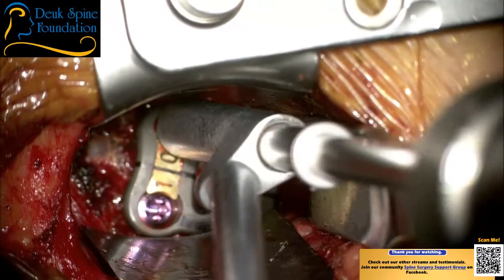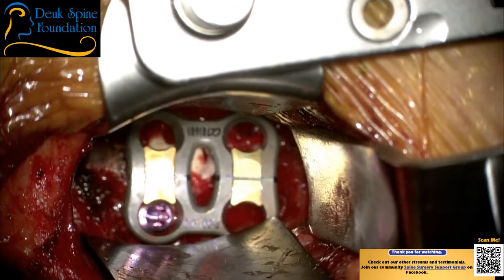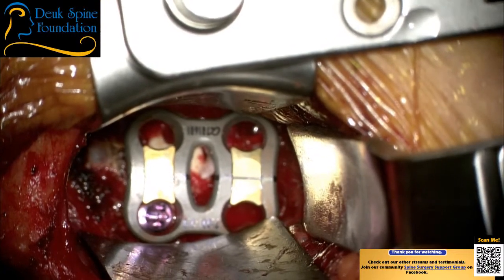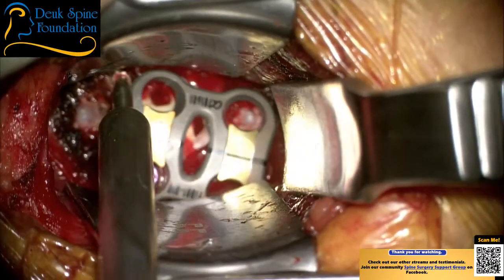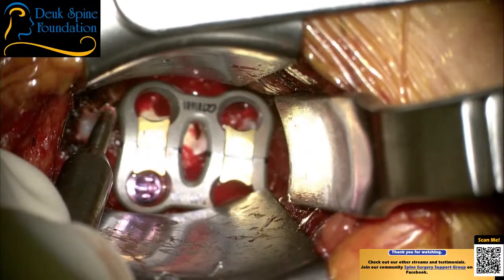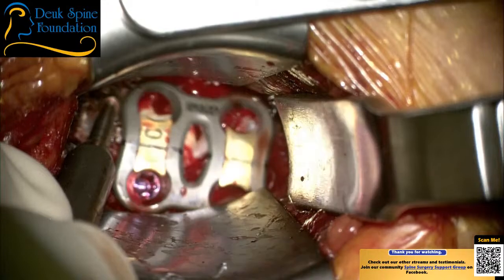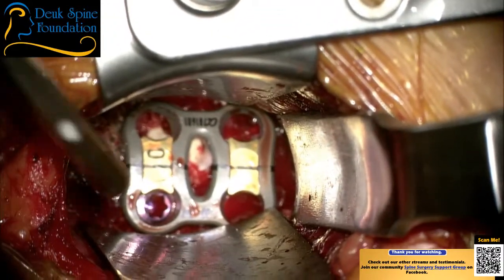People think being a surgeon is easy, but it takes tremendous thought. Let me have the drill. Yes, sir. The other drill, okay? There's a little spur right here I'm not happy about. See that? I'm going to have to get rid of it. That's why we get you? Take. Done.